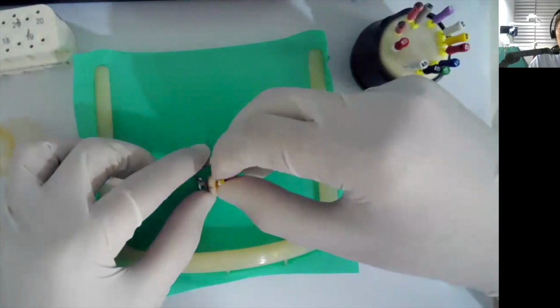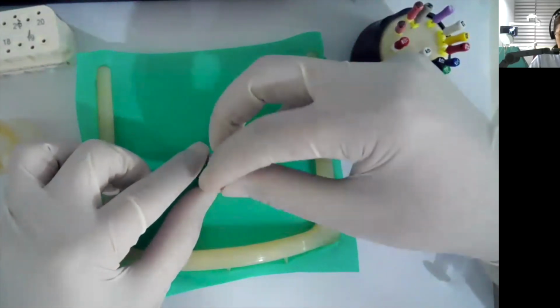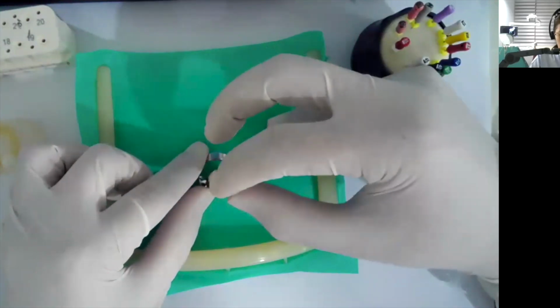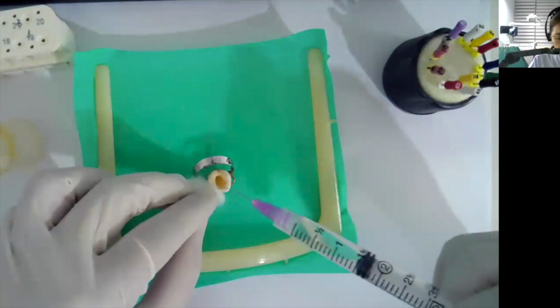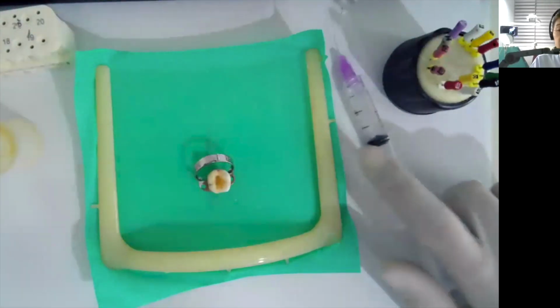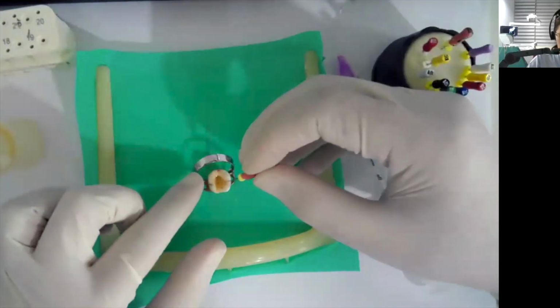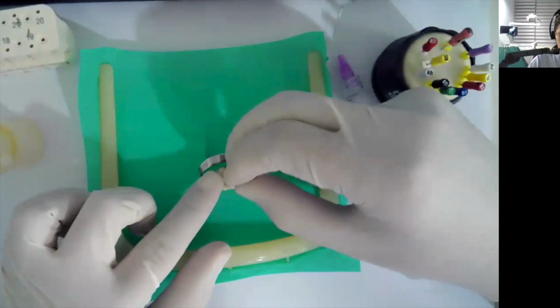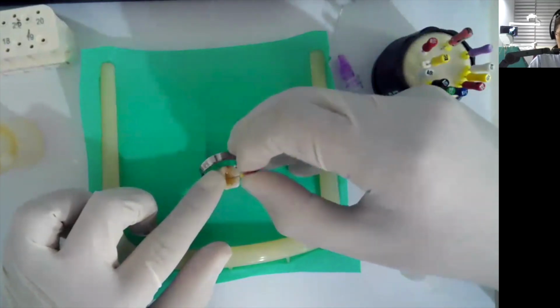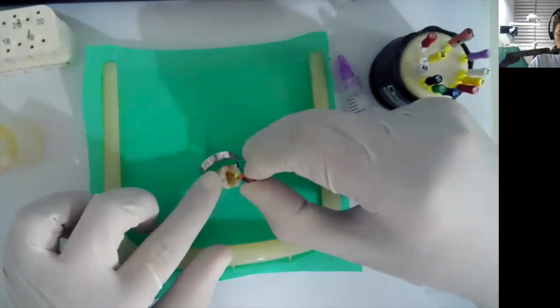Then I go to mesiolingual. I'll do the same on the distal. And after irrigation, we do the patency again. Whatever system you're using, always go back to your patency file. See, it can easily get in now. I will also do the same on the mesiolingual. And then I'll go for the distal.